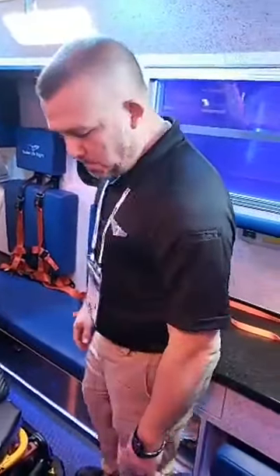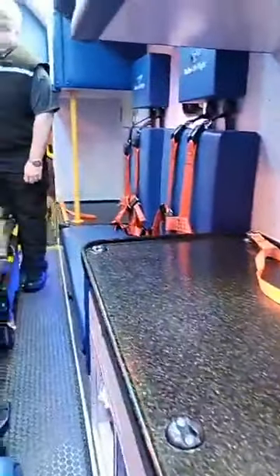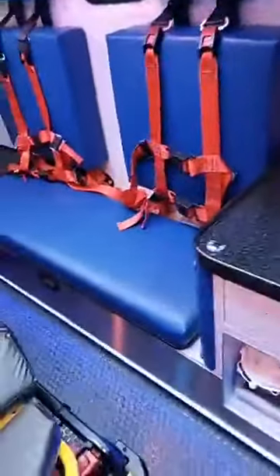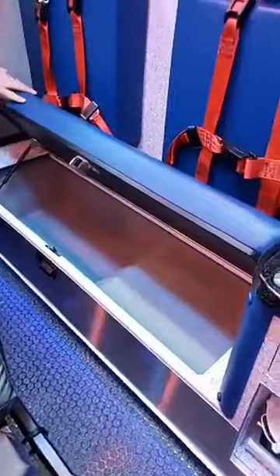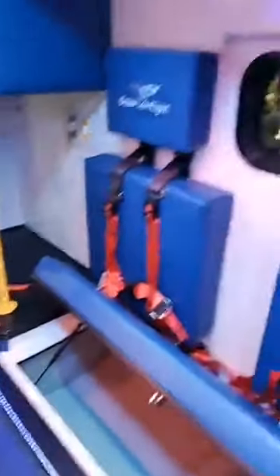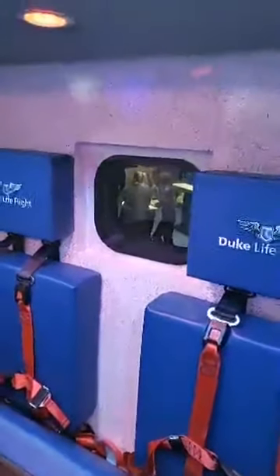So let's talk about this side wall over here. On this side wall, I noticed we got a double-seated position with storage underneath. What are you guys putting down in there? So underneath this storage, we'll eventually keep our Technomount Extension Pro. That will live in that compartment. Probably some linen, things like that. Even though we took some cabinetry away, we still have to have places to put some of the stuff that we do carry. So that's a perfect place. It's a great option that you guys had for us.